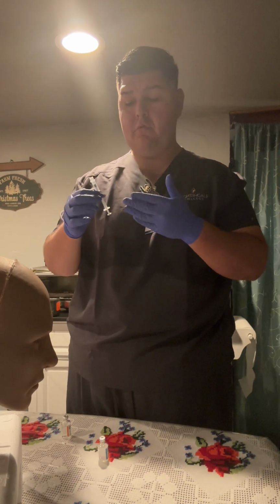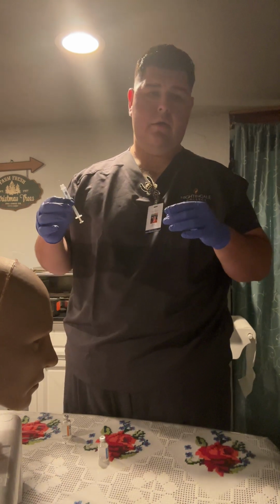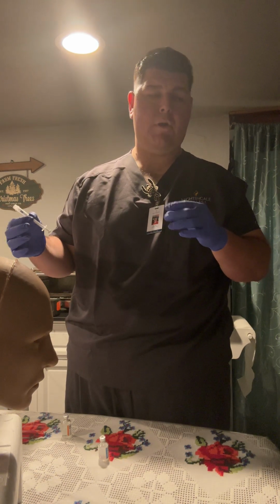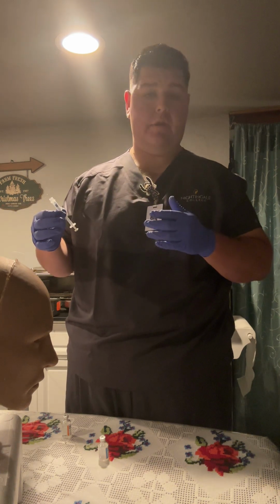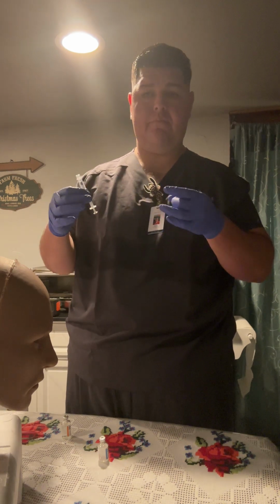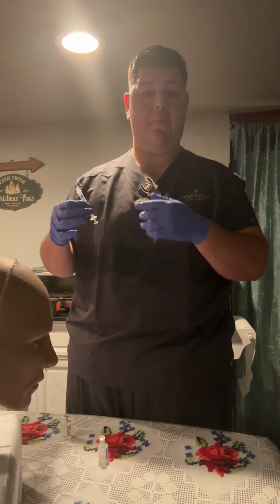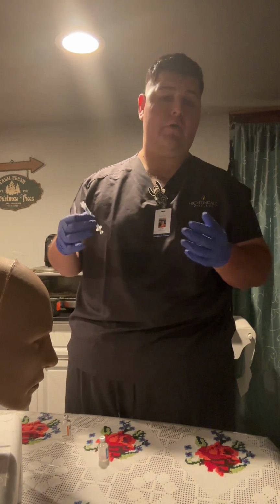If there's any bubbles, I wanted to reiterate that and point that out. If there's any bubbles, I can flick it, or push the insulin. Well, in this case, I can't push it because I have the other insulin in. I don't want to cross them in the same vial, but I can just tap the syringe to get the air bubbles out. I didn't see any air bubbles in this circumstance, so I didn't do any of that.